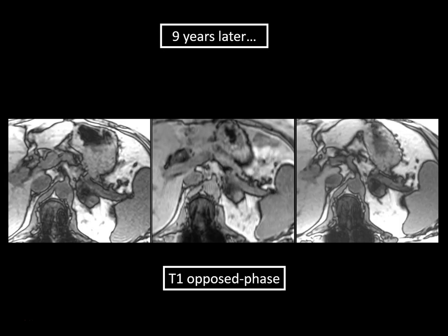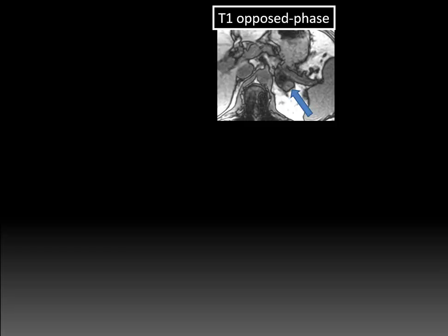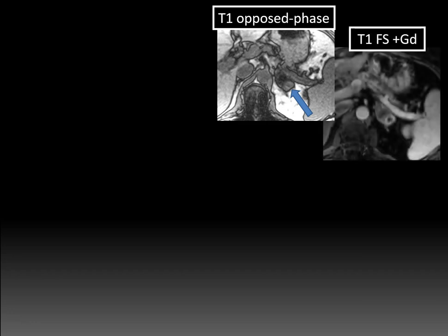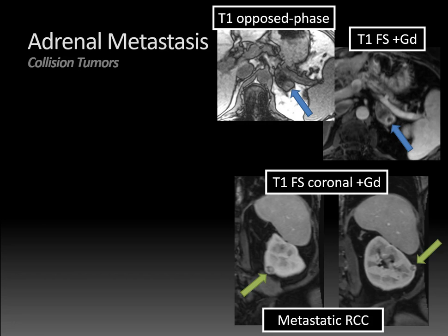Jumping ahead nine years later, we have three separate MRIs showing opposed-phase T1-weighted images, arranged oldest on the right and newest on the left. The adrenal adenoma shows signal dropout again, but there's also a new area of defect in the dropout region that is enlarging over time. On the T1 opposed-phase image, the defect within the area of signal dropout is apparent. On the post-contrast image, there's a rim-enhancing lesion within this adrenal gland. T1 fat-suppressed coronal post-contrast images show multiple solid-enhancing renal masses indicating recurrent metastatic renal cell carcinoma — another example of a collision tumor, this time a renal cell metastasis to a gland containing an adrenal adenoma.